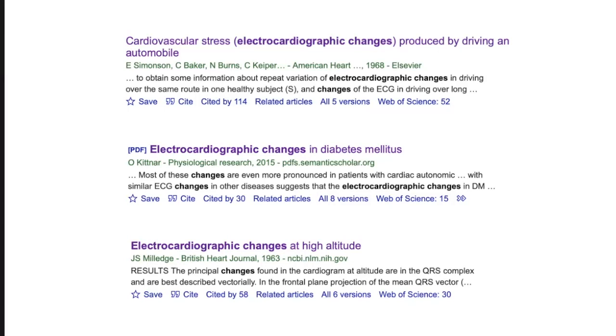And in our world, where we do ECG imaging, we're trying to get around some of those ambiguities, to do the best we can from a body surface measurement to determine what the underlying electrical activity of the heart is. That problem is, again, ambiguous to some extent, and the physics equivalent of that is that the problem is ill-posed.